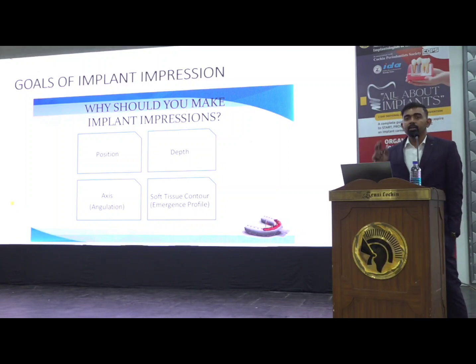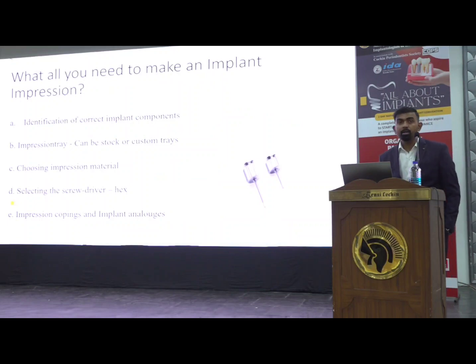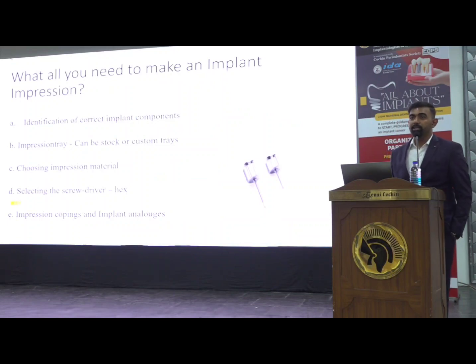Angulation is comparing to the adjacent vital structures, the amount of taper and angulation that should be properly recorded in the implant impression. And the final one is soft tissue contour and/or emergence profile. Basically 4 goals: first position, second depth, third angulation, and fourth soft tissue contour.